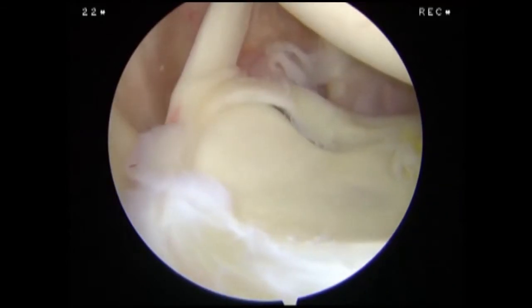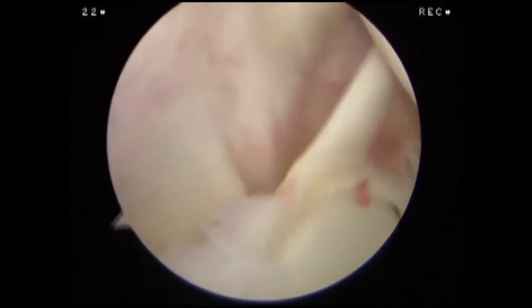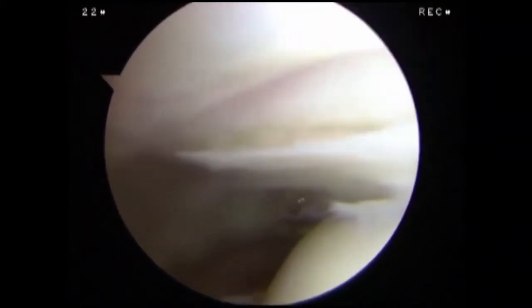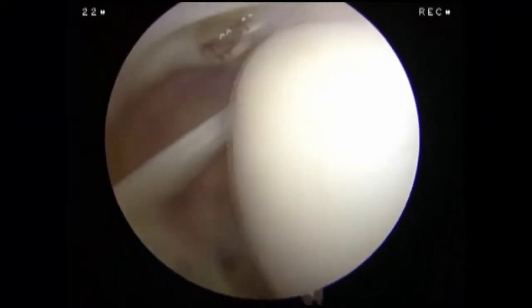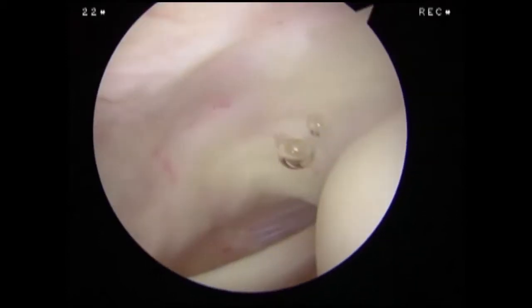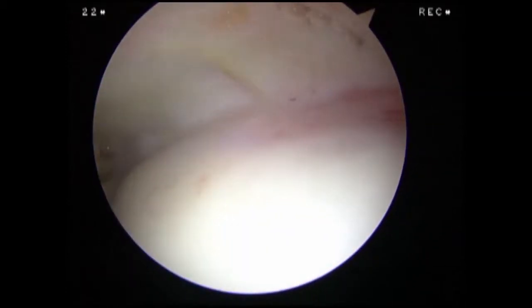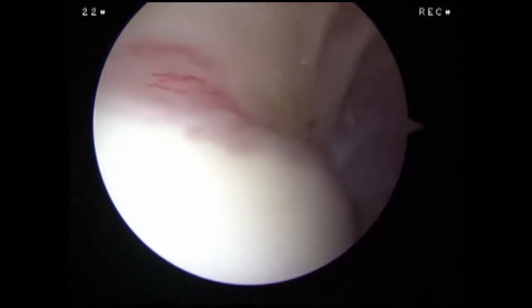From our starting position, we begin our assessment of the humeral aspect of the joint space by examining the attachments of the supraspinatus and infraspinatus tendons to the humeral head. We continue to rotate posteriorly and inferiorly to visualize the articular surface of the humeral head, including the bare area.